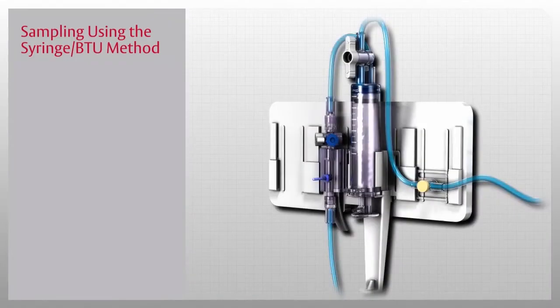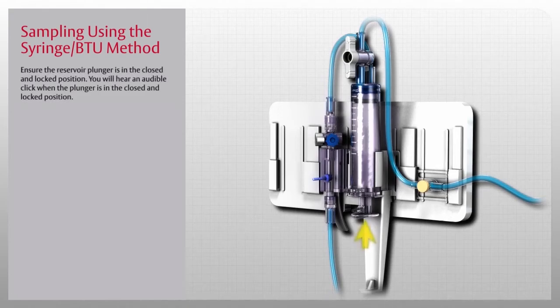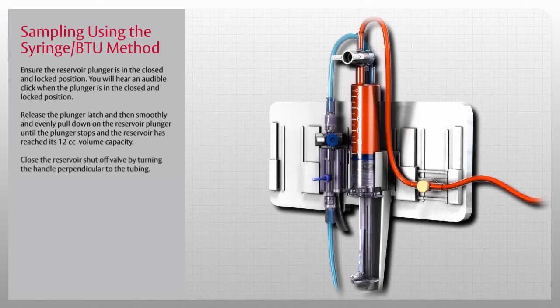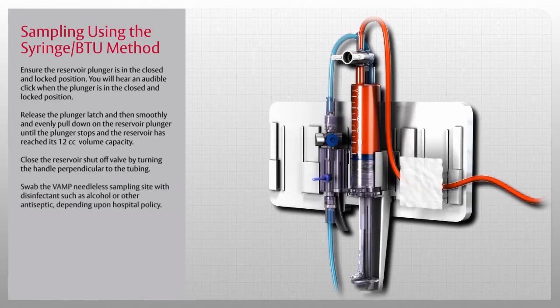Now let's review the method of taking a sample using a syringe and blood transfer unit, or BTU. First, ensure the reservoir plunger is in the closed and locked position — you will hear an audible click when it is in place. Release the plunger latch and smoothly and evenly pull down on the reservoir plunger until it stops and the reservoir has reached its 12cc volume capacity. Once the clearing sample has been drawn, close the reservoir shutoff valve by turning the handle perpendicular to the tubing to ensure the sample drawn is from the patient and not from the reservoir.